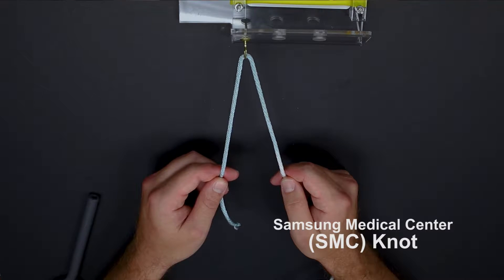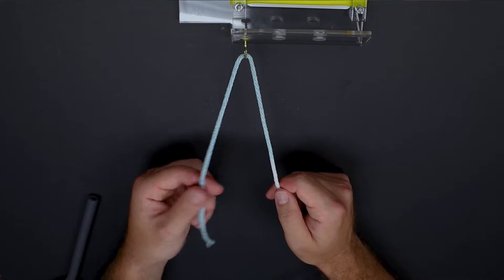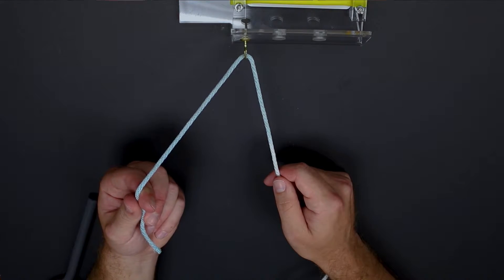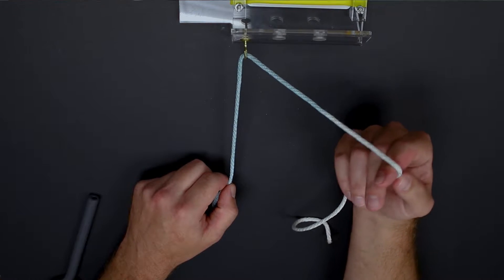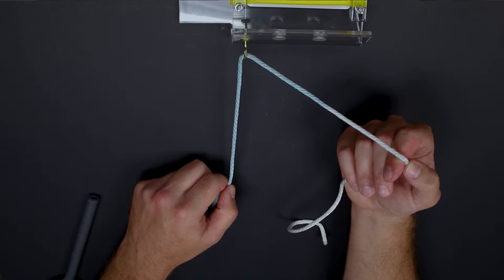The SMC knot or Samsung Medical Center knot is a sliding locking knot. This is tied by first starting with the post limb, in this instance the left hand colored blue, and your loop limb in this instance in my right hand colored white.